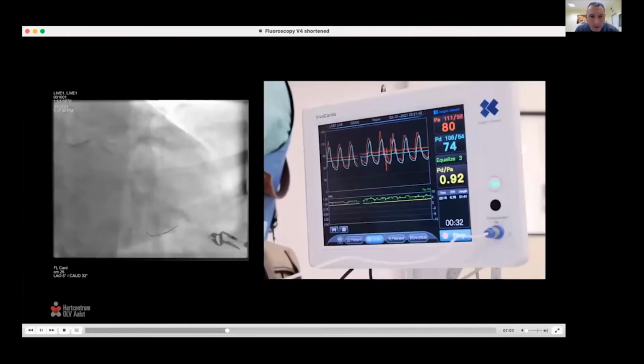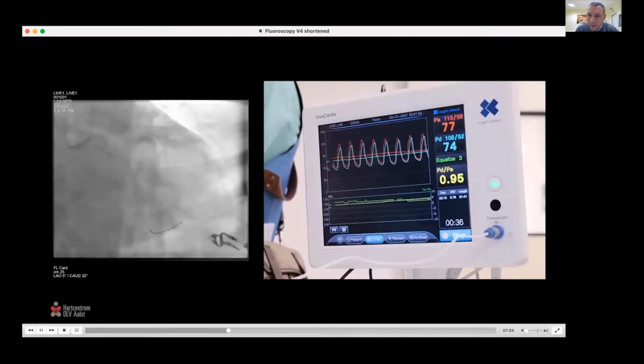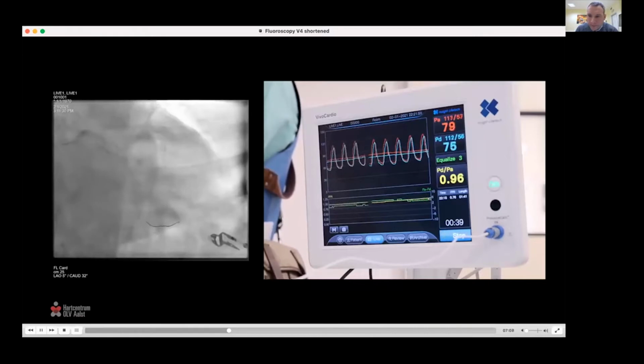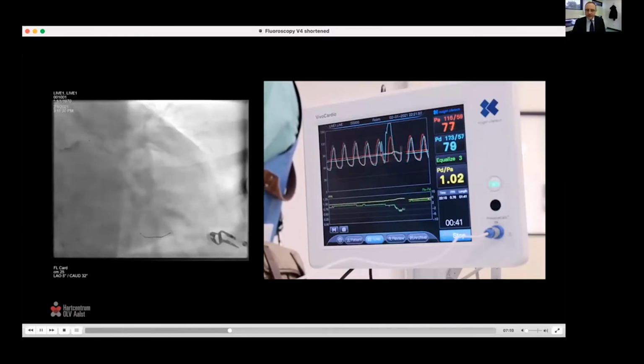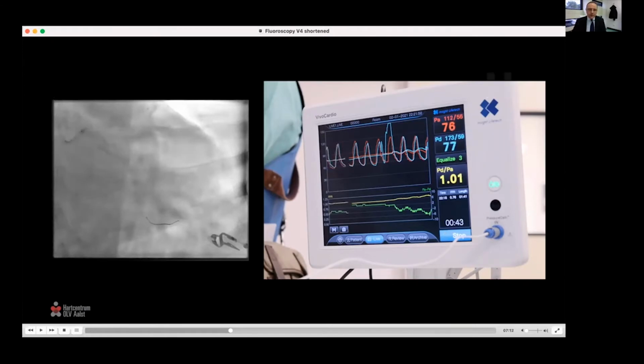Sorry, Emanuele, just a quick question. After papaverine, do you flush with saline, or do you just inject papaverine and wait? No, we flush with saline. As you noticed, Simone, I injected 3 cc within the dead space of the guiding catheter. And when you saw me injecting saline, it was just pushing forward the papaverine that was already in the dead space of the guiding catheter. So in a way, yes, to give you an answer.